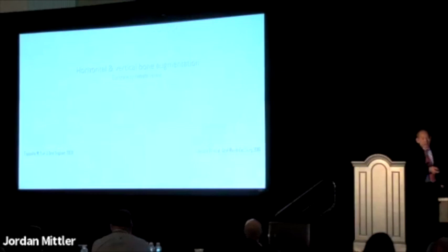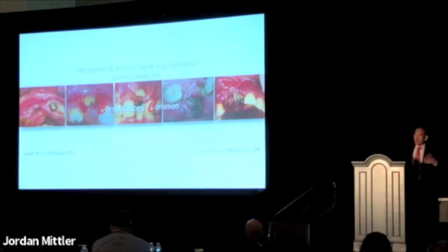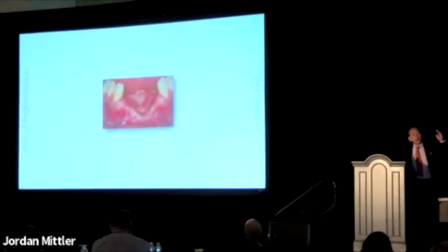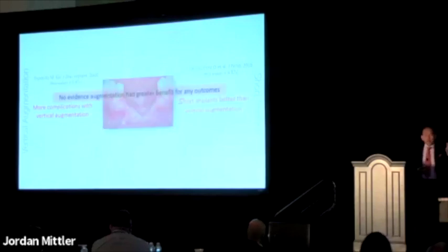Then, besides implant diameter, there's implant length. Grafting is not always predictable, especially vertical augmentation, as we know, right? Grafting is fraught with complications. I do a lot of grafting. I'm not against grafting, but when you can avoid it, you should. Systematic reviews have shown that if you had to do any kind of vertical grafting versus placing a shorter implant, you should always choose the short implant if the patient accepts it. Systematic reviews from 15 years ago and meta-analyses of randomized controlled studies showed that. And fast forward 10 years, same thing: short implants work better than grafting.